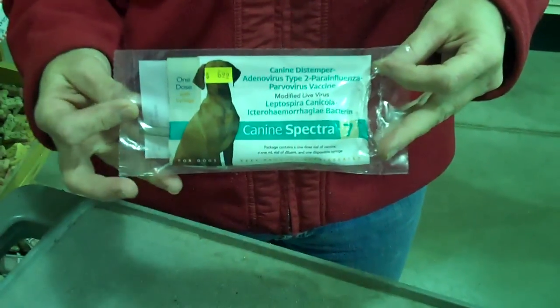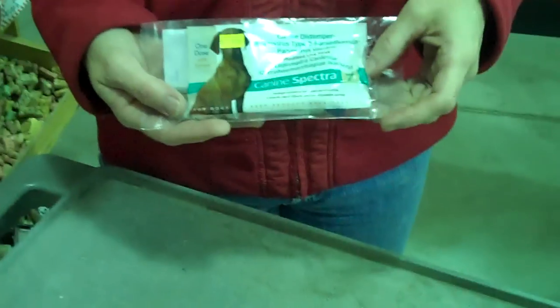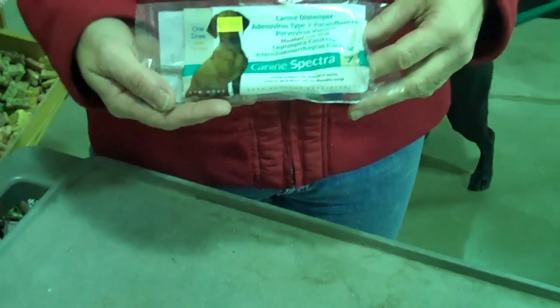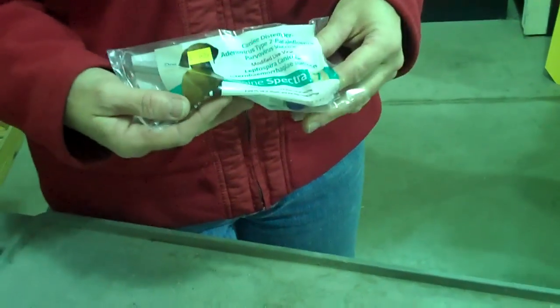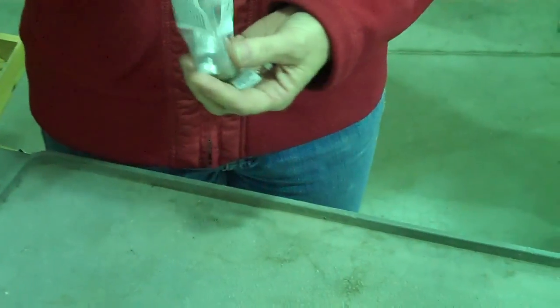Today for a helpful hint we have our manager Kelly helping us. We get a lot of questions about vaccinating your dogs. We've got Kelly and Wendy here with Wendy's dog and we'll be vaccinating her today. Kelly's going to show you how to do that.